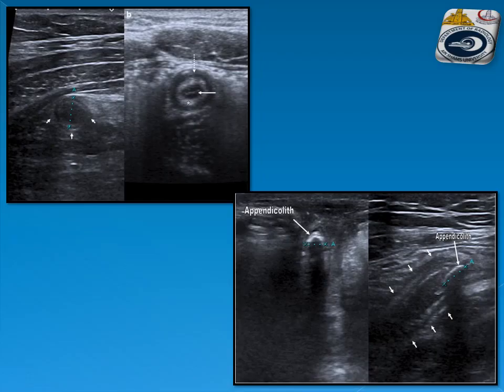Another example: the appendix is thickened, with an echogenic structure within the lumen of the appendix — an appendicolith — appearing with posterior acoustic shadowing.